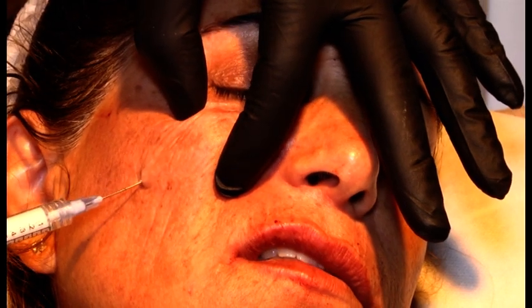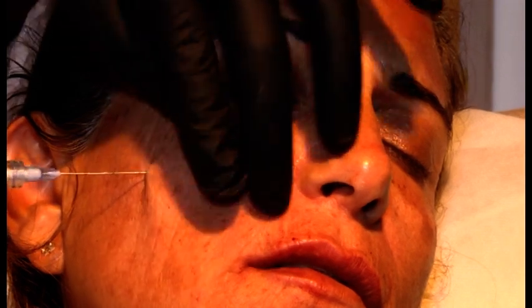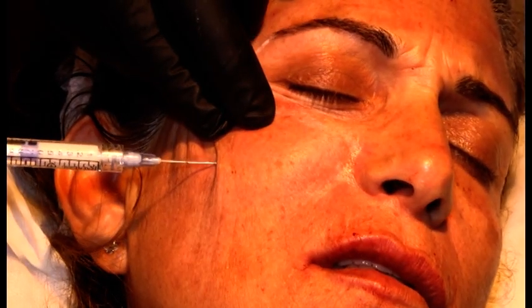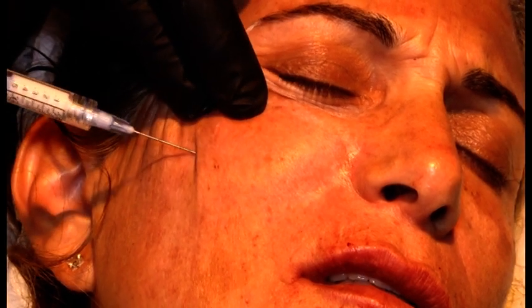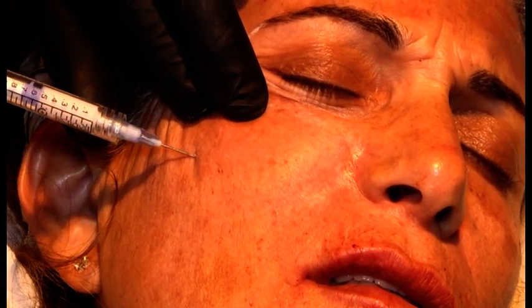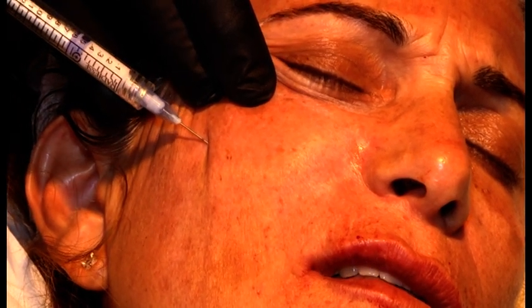And she's getting a little bit tired of me now. Click through, bolus, retrograde. Click through, bolus, retrograde.